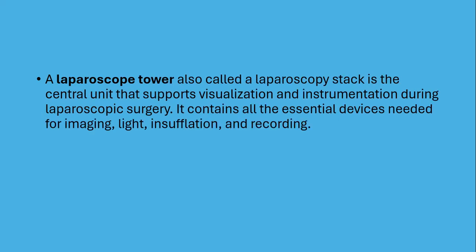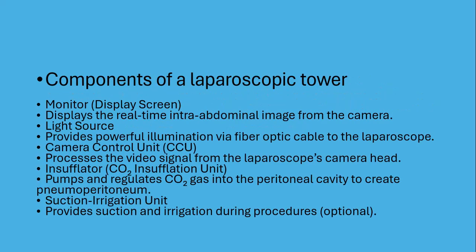A laparoscope tower, also called a laparoscopy stack, is the central unit that supports visualization and instrumentation during laparoscopic surgery. It contains all the essential devices needed for imaging, light, insufflation, and recording. Components of a laparoscopic tower.